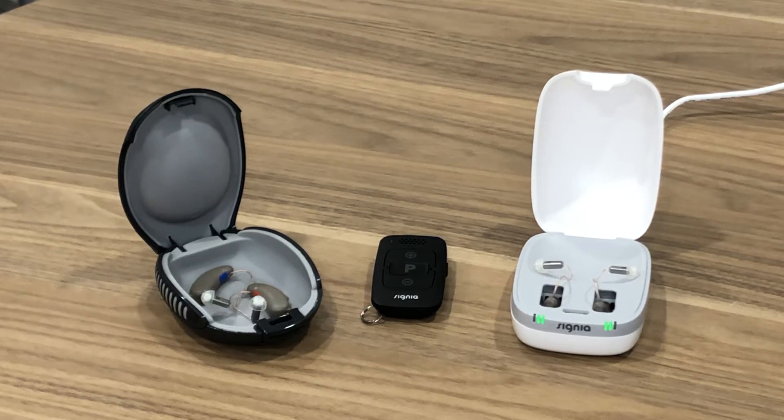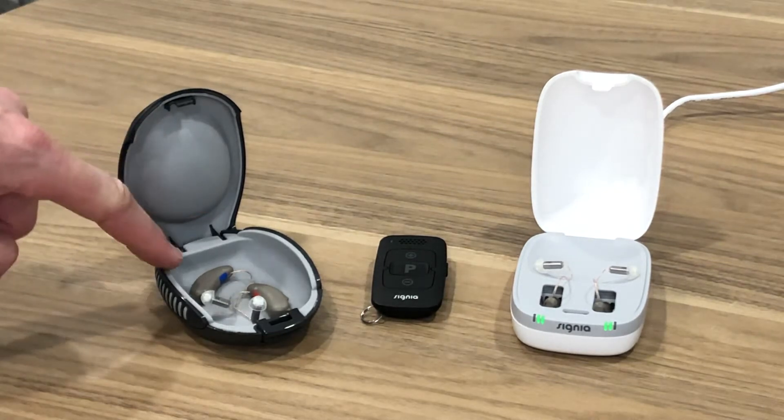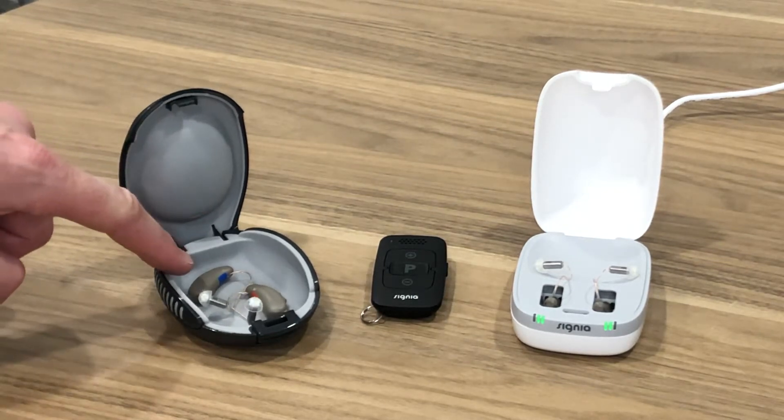Hi, David Cox here from East Coast Hearing. Here in front of me on the table I've got a few sets of hearing aids. These are the Signia Pure 312 hearing aids.